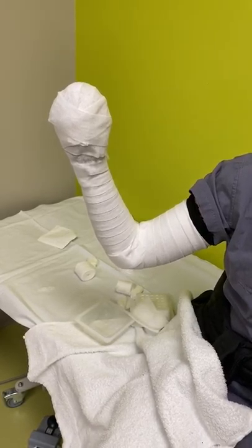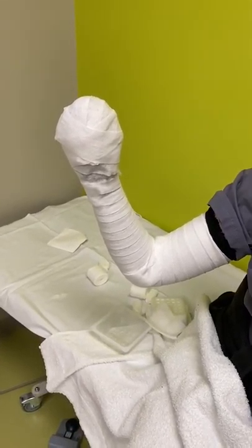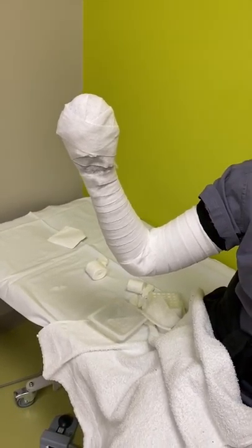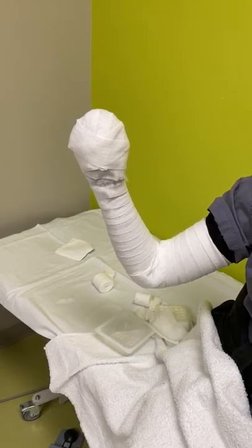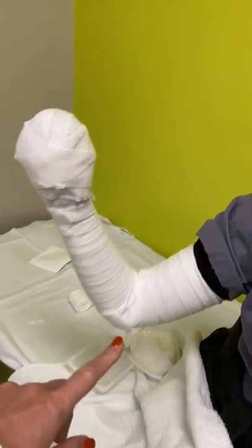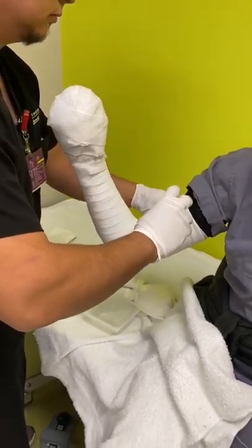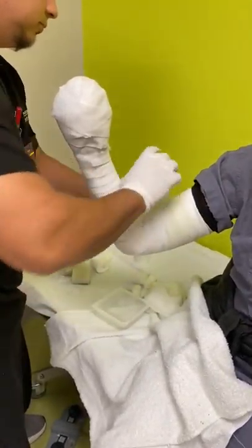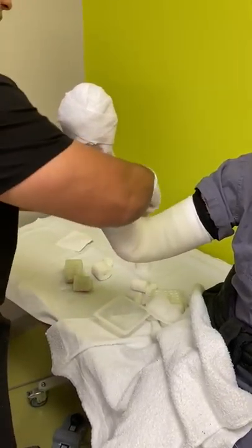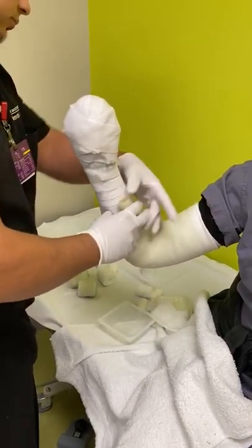Times when you would use a mitten cast are for patients under the age of four, for finger amputations — which is pretty common with slamming doors — and finger fractures. Needing a long arm cast: if you were to put a short arm cast on a patient with a very small arm, it'll just slip right off. With a mitten cast, four- and three-year-olds are curious; they want to look at the fracture and mess with any sort of bandage. If you put a mitten cast over the injury, they're not able to access it.